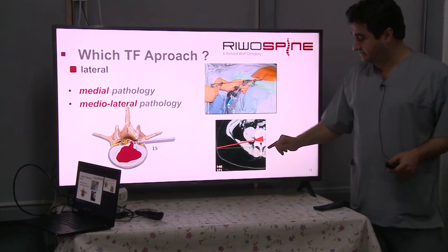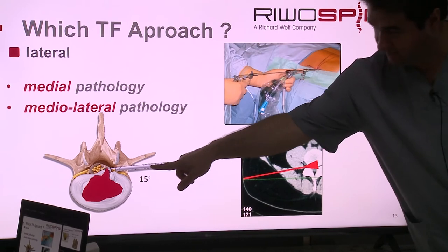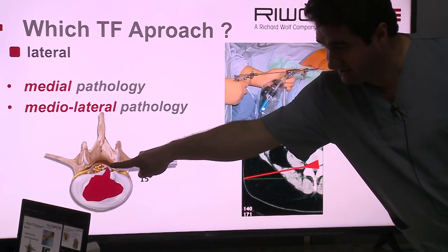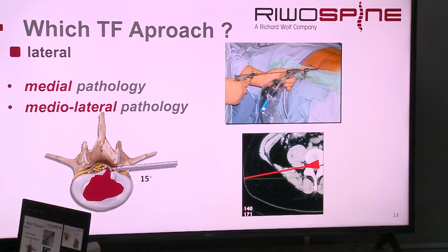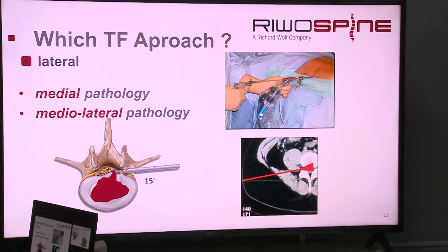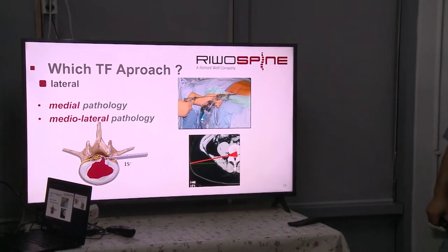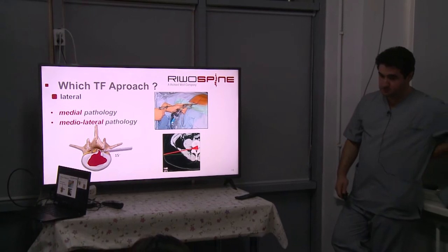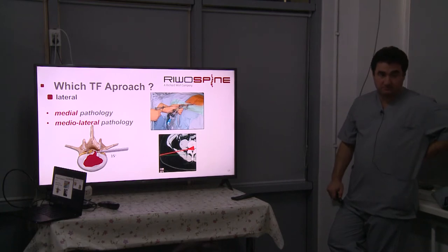With the lateral transforaminal approach, we find the entry point according to the anatomical structure, not by measurement. And with this, the working angle is 15 degrees, and you can easily reach the ventral epidural space here without any problem with the facet joint. Actually, if there is a stenosis, we don't prefer to do it transforaminally.